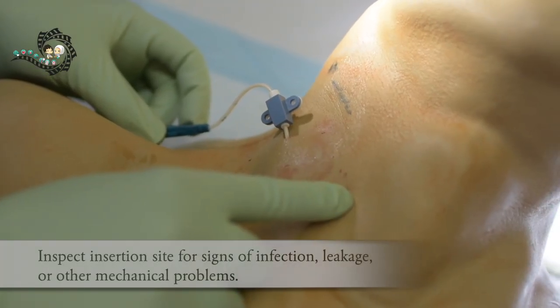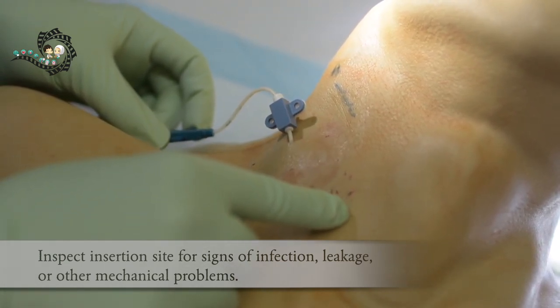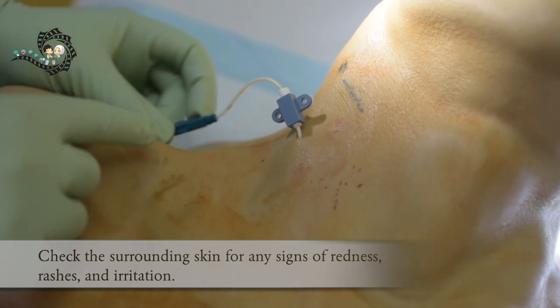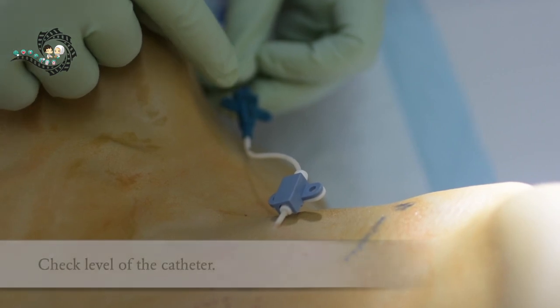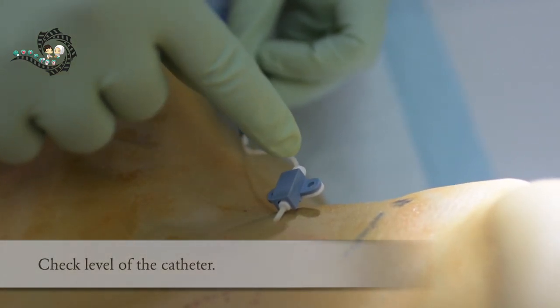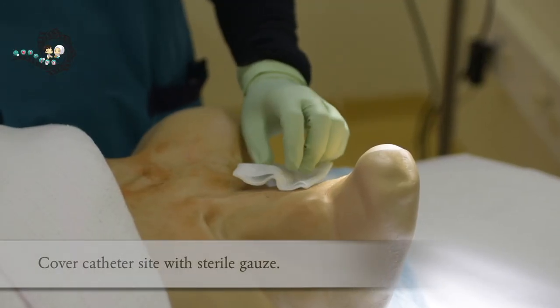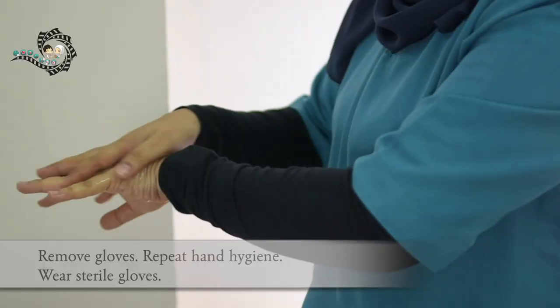Inspect the insertion site for signs of infection, leakage, or other mechanical problems, and the surrounding skin for any signs of redness, skin rashes, and irritation. Check the level of the catheter to confirm the catheter is in the original position. Cover the catheter site with the sterile gauze. Remove gloves. Repeat hand hygiene.